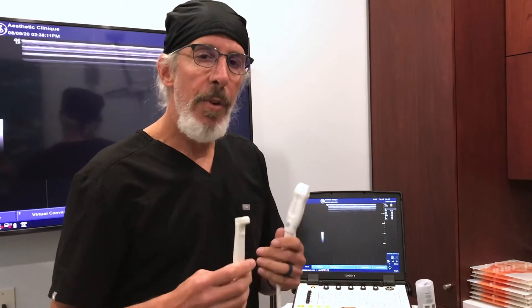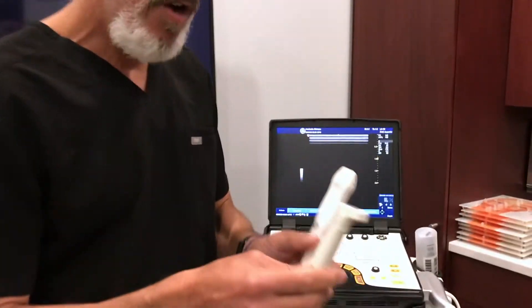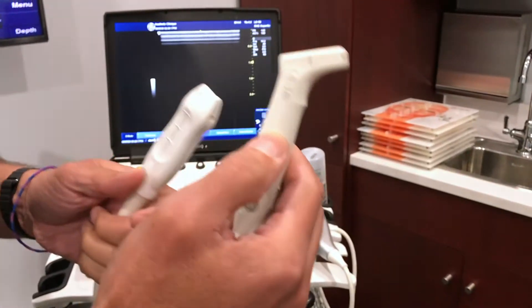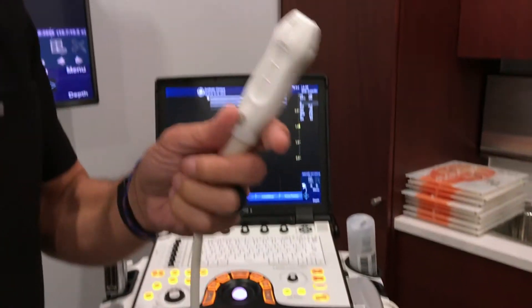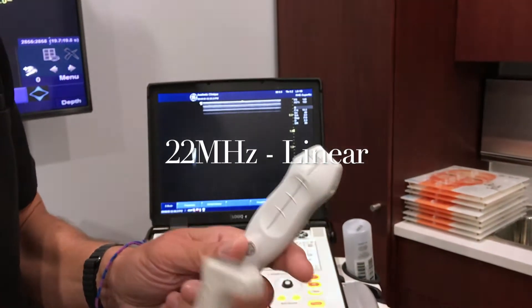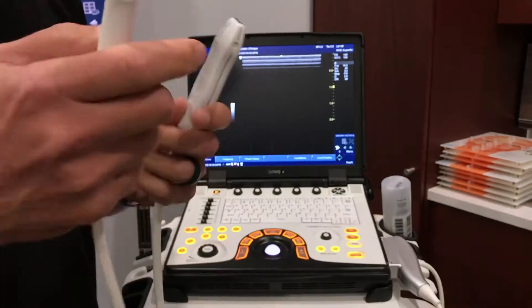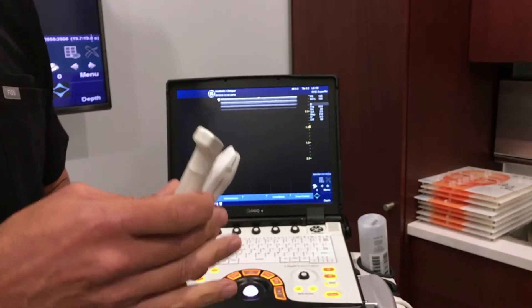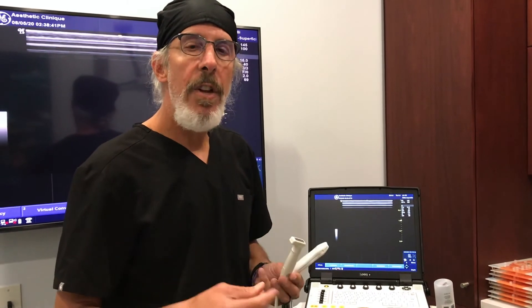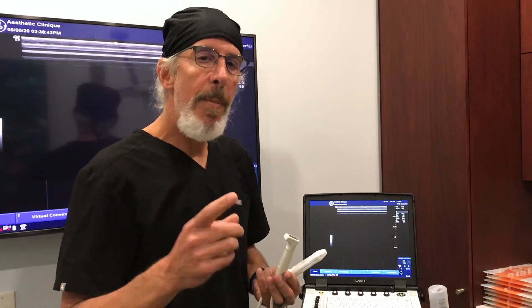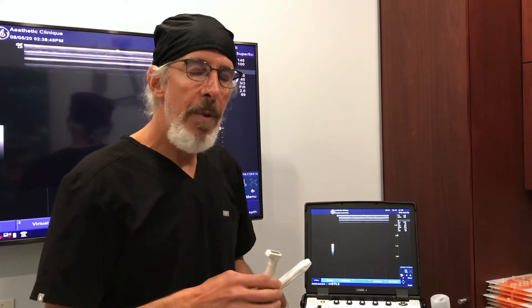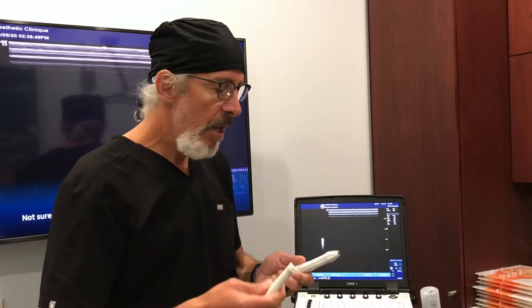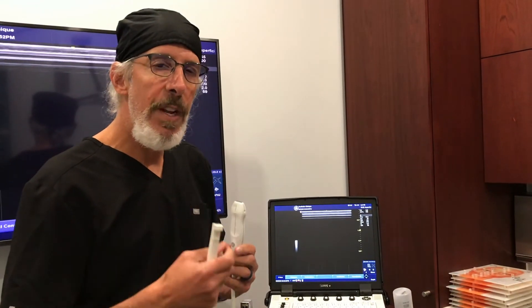Let me briefly go over the probes that I use. I have two probes: this is an 18 megahertz probe, also called a hockey stick probe, and this is a 22 megahertz linear probe. I mainly use the hockey stick 18 megahertz probe. The higher the megahertz, the more definition you get, but you can't go quite as deep. The 22 megahertz probe is more superficial — it's more for skin.